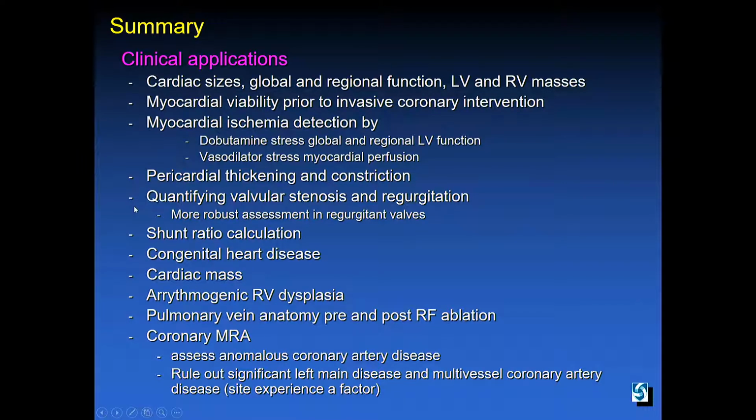So the quick way to think about it is that if you have a question about cardiac structures and tissue components, then MRI is a very good test. That's why MRI is a very good test to look at ischemia, viability, and etiology of cardiomyopathy. MRI is also very good to quantify the different degrees of valvular dysfunction, and it's more robust in assessing regurgitant lesions than stenotic lesions. Stenoses, I think, are very well assessed by echocardiography.